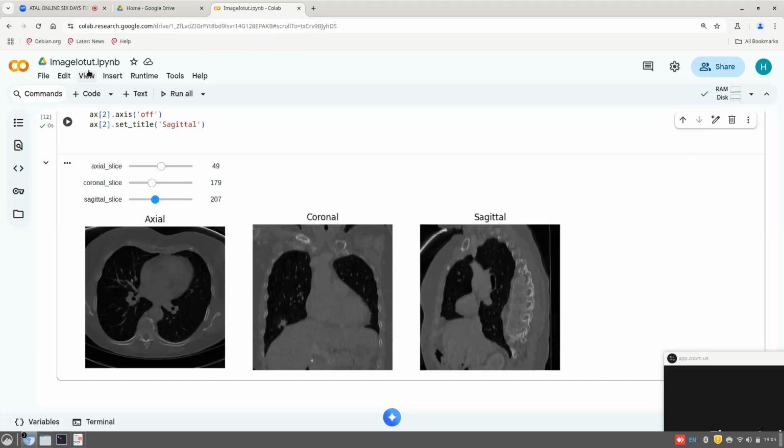And you can use the imageio library or PyDicom library. Generally, the images will be stored in DICOM format in any hospital X-ray machine output. You will also get JPEG or PNG images nowadays. With digital X-ray in a lot of facilities, software has come up where the X-ray image can be exported as JPEG and PNG images. But ideally, for all the medical image communications, the recommended world standard is DICOM format for any hospital information system.